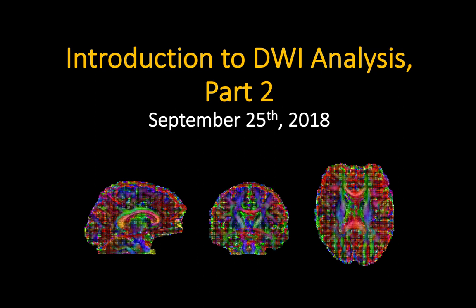So as I mentioned, the first part of this was in the early part of August, first week of August. And back then, we did something called diffusion tensor imaging. And I want to clarify right off the bat some of the terms we're going to use, because some people say that they collect DTI scans. That's not technically true. We collect diffusion-weighted scans, and then we have options about what we want to do with that afterwards. It's a technique for mapping white matter tracts primarily.